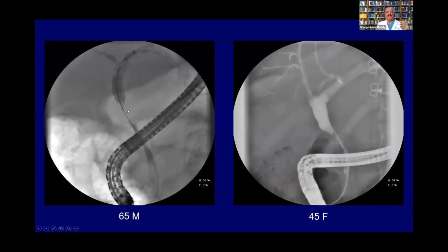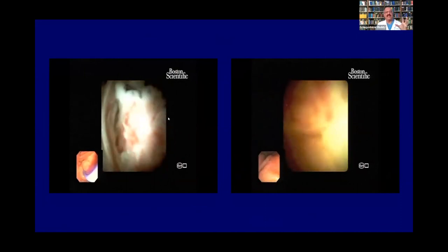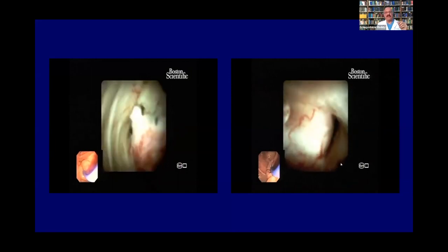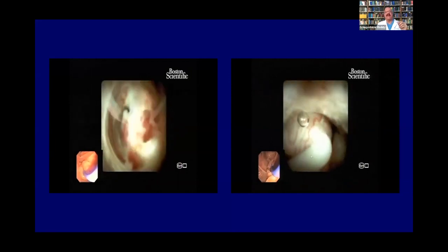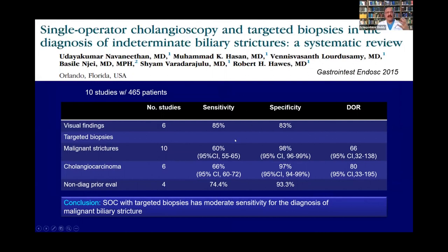Here's a dramatic example: two strictures, high-CBD and mid-CBD, both looked like cholangiocarcinoma. All other investigations were normal. When we did cholangioscopy, we found very interesting pictures. On the left, a high-CBD stricture showed a polypoid lesion — biopsies revealed B-cell lymphoma, treated with radiation and chemotherapy. On the right, caseating material was coming out — tuberculosis. Both conditions that would have gone for surgery were instead treated very adequately. Systematic research by Navaneetan confirmed cholangioscopy has very high sensitivity and specificity in indeterminate biliary strictures.